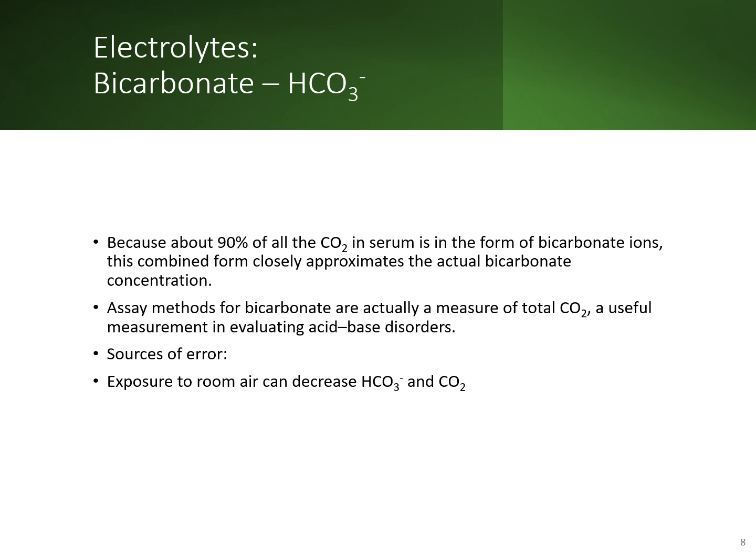So assay methods for bicarbonate are actually measuring total CO2. This is also a useful test to help with evaluating the acid-base balance and determine if there's any sort of disturbance going on. Sources of error would be if the sample was exposed to room air, which can cause the bicarbonate or CO2 to leach out, so you would get a false reading.